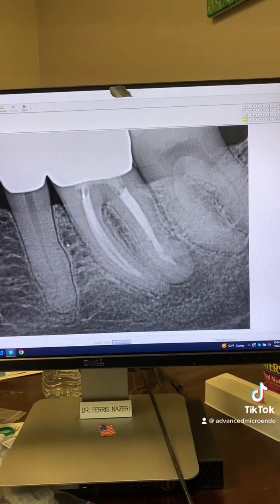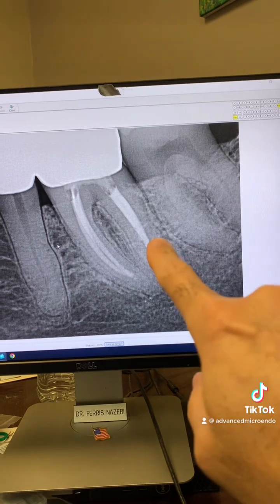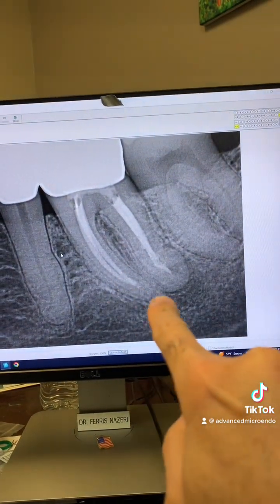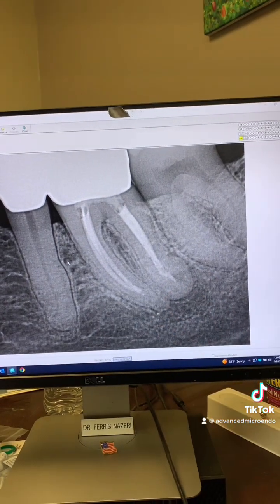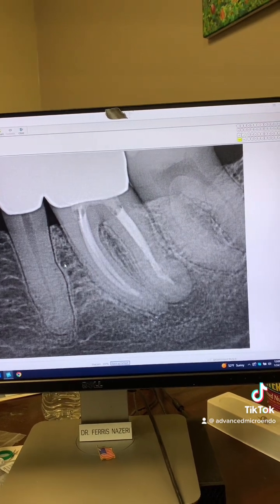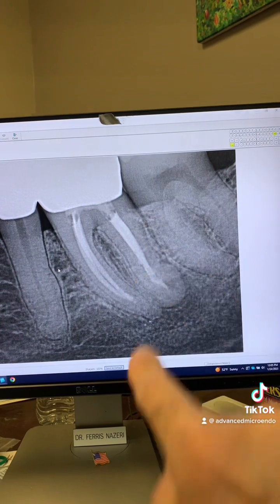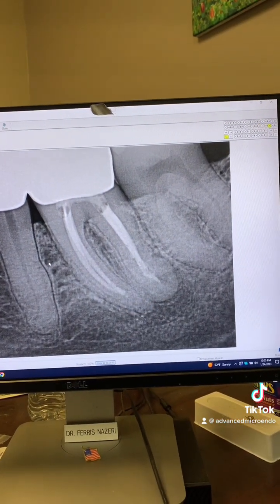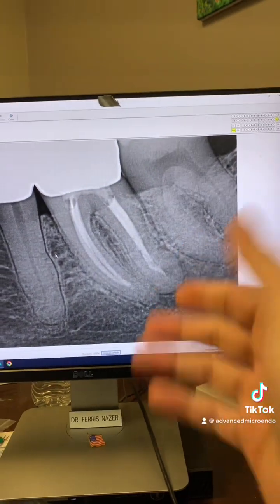We discussed options with the patient, and the patient decided he wanted to try to see if the tooth could be saved. As you can see, the previous root canal is there along with the porcelain crown. Short fills, periapical lucency here and here. My goal would be to go through the porcelain crown, remove the buildup, remove the gutta-percha, and see why this dentist instrumented and filled short. And that's what we did today.